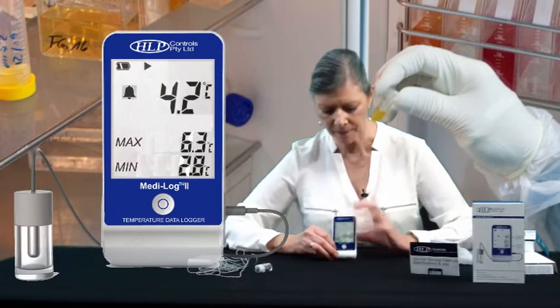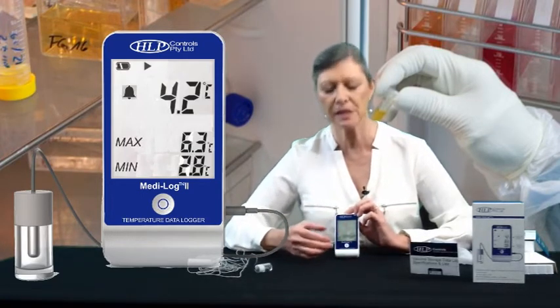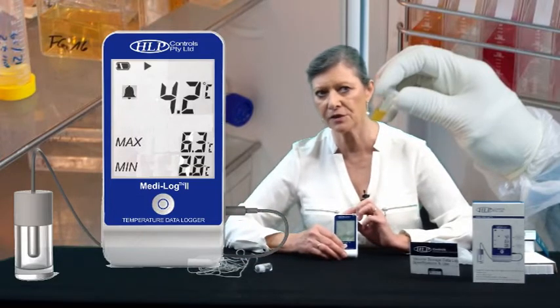Now the main features of this unit are: it's a one-button control. You don't have lots and lots of confusing buttons where you have to learn what each one does. It's a one-button control — nice and easy to use.